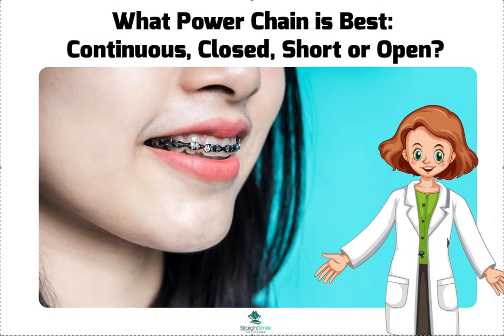Those are the ones where the links are right up next to one another. When you put it on, you just put it on by feel. If you have a big tooth gap or extra space, you can just leave extra links. See here — one link, two links — they stretched it over the little tooth with two links. So if you use continuous or closed chain, you don't have to also buy short and open chain, because you can just leave extra links. It actually looks pretty cool — there are all different ways you can twist and do cool decorations.